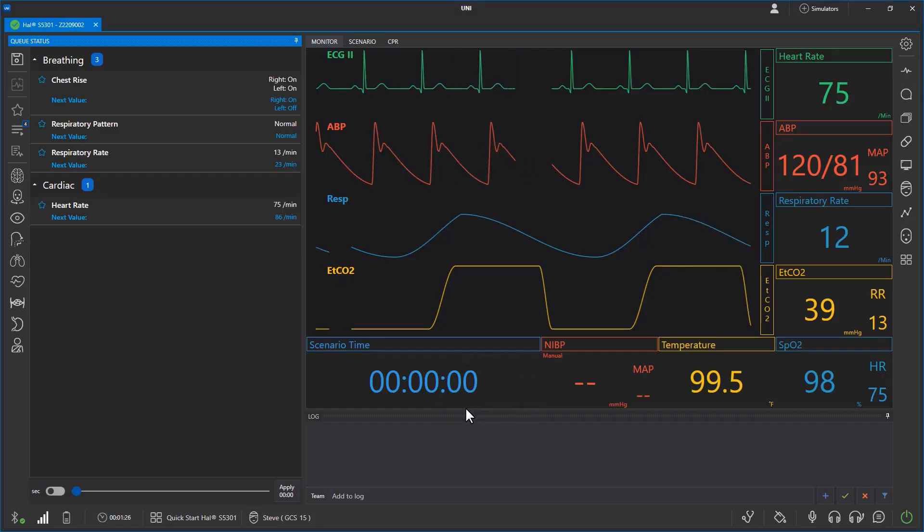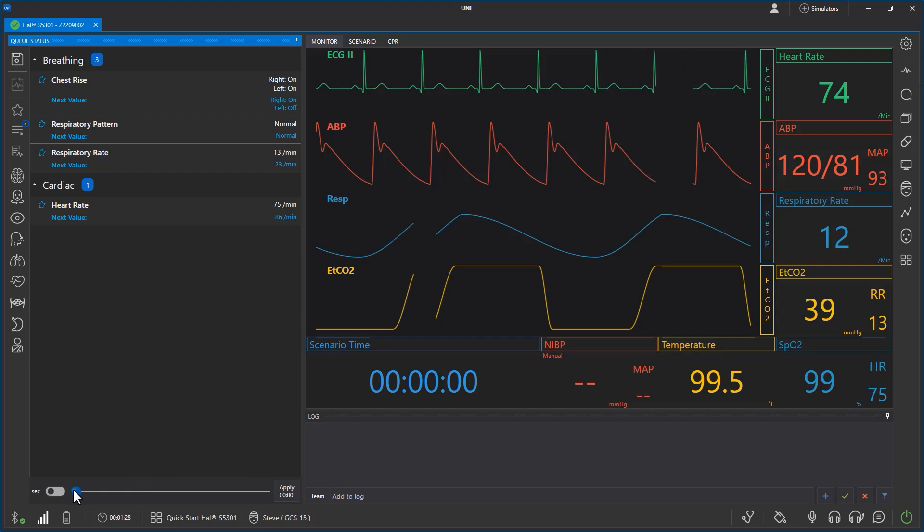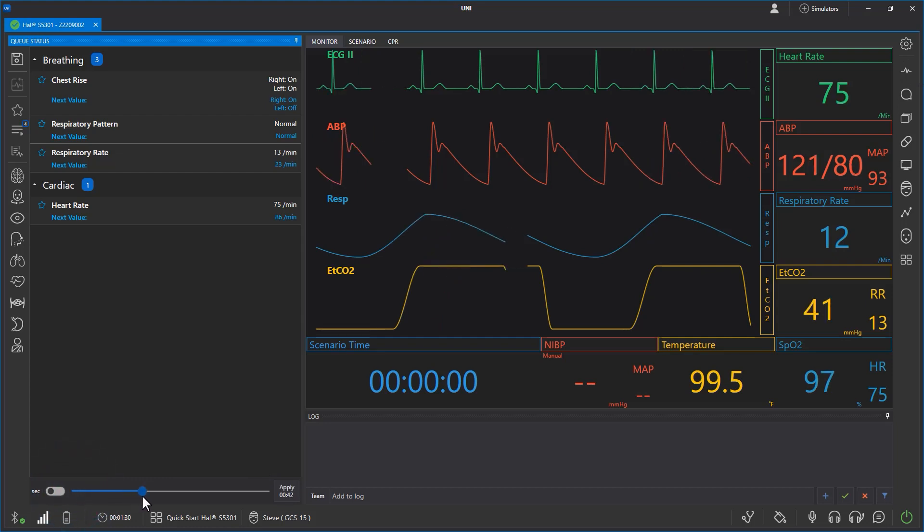When you're satisfied with the cue, select a time interval by moving the slider, then press apply.